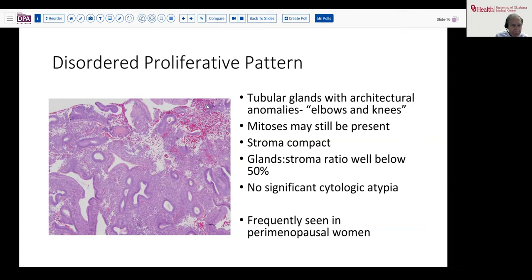Another common finding, particularly because the age group most commonly biopsied is the perimenopausal age group, is what is termed a disordered proliferative pattern. This is a distinct pattern but has some overlap and may have some continuity to early hyperplasias. Essentially you have tubular glands that have some architectural abnormality — so-called elbows and knees — they get angulated and show a little budding. They will still be mitotically active. The stroma is compact, but in general the gland-to-stroma ratio is well below 50 percent and there's no cytologic atypia.